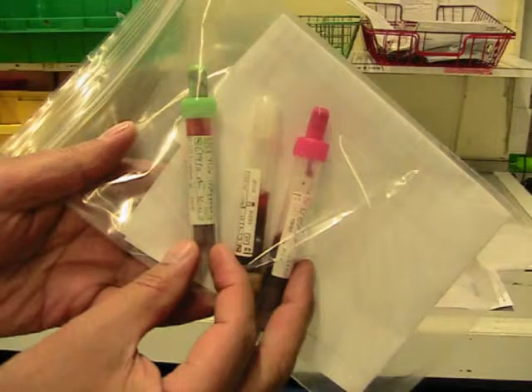An additional test is a coagulation sample, which is a green top. Again, specific colored tops, there's a reason for them. They may contain an anticoagulant to stop the blood from clotting, or another anticoagulant which may stop it temporarily from clotting, which is the green one. The gel basically is a clotted sample, and what we're using there is serum, whereas with the green one, we're using the plasma. There is a difference between the serum and the plasma, which I'll let you work out.